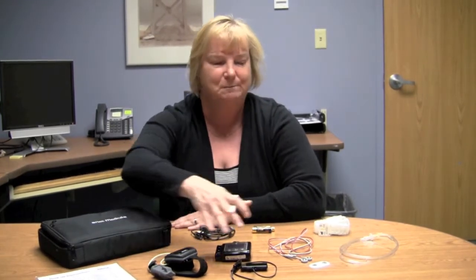Congratulations on your purchase of the Knox T3 home sleep monitoring system. Today we're going to look at all the parts and pieces that come with your system and how to set up and prepare for your first patient. It's easy to do, so let's get started.